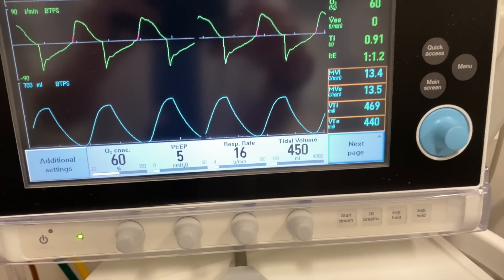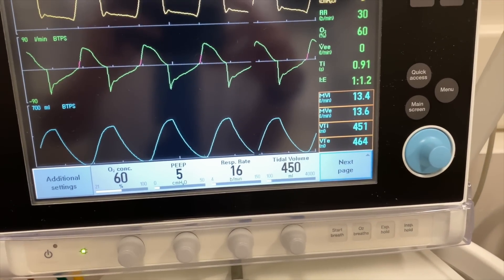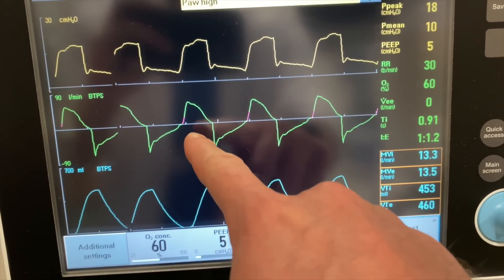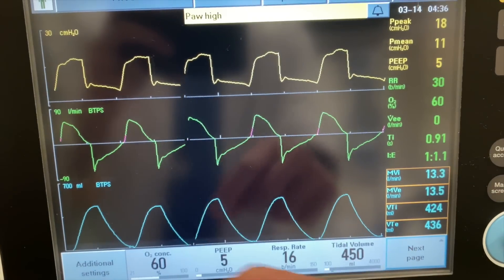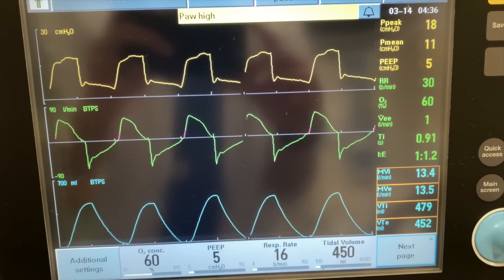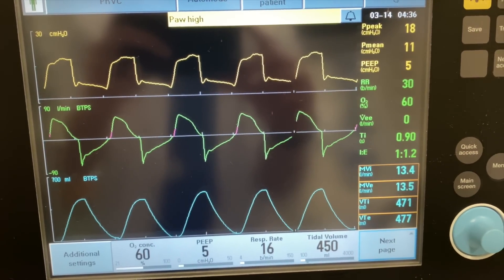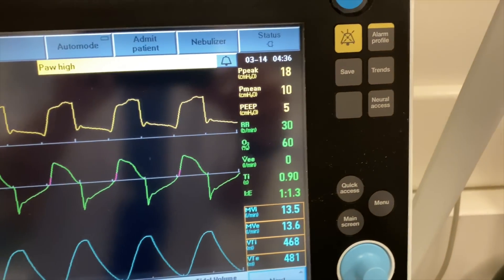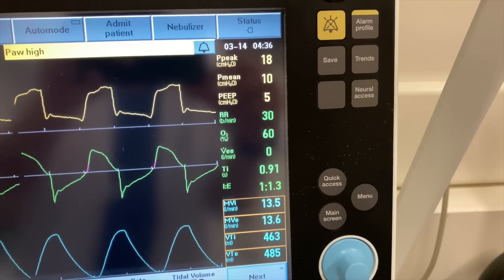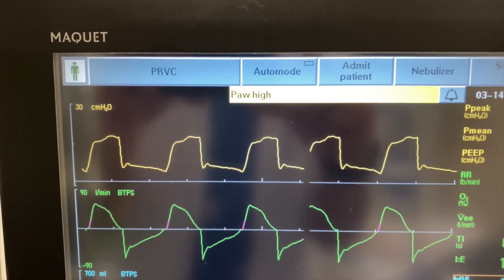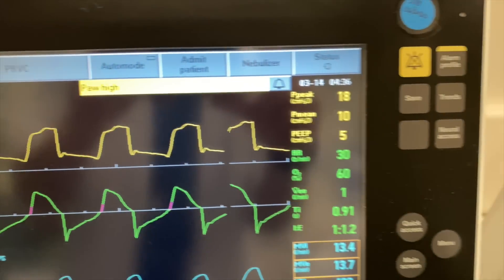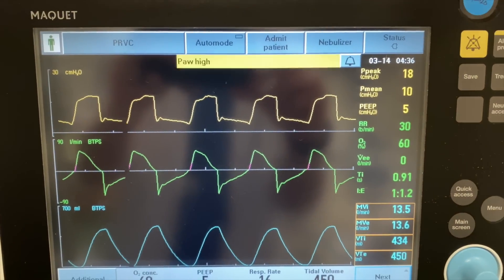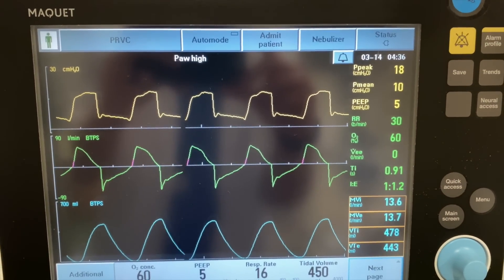In this particular case, these are the settings for this individual. If you notice right here on these waveforms, you see where it's pink — that pink right there means that the patient is breathing over the ventilator. So just keep that in mind. By the way, this vent setting is PRVC, which is a pretty standard mode that if you just need something simple to get by, this will get the job done for you.